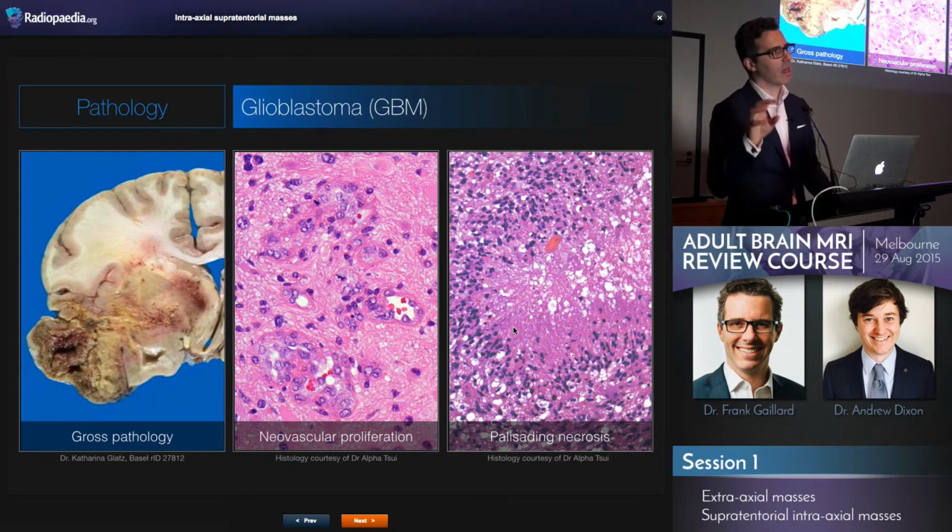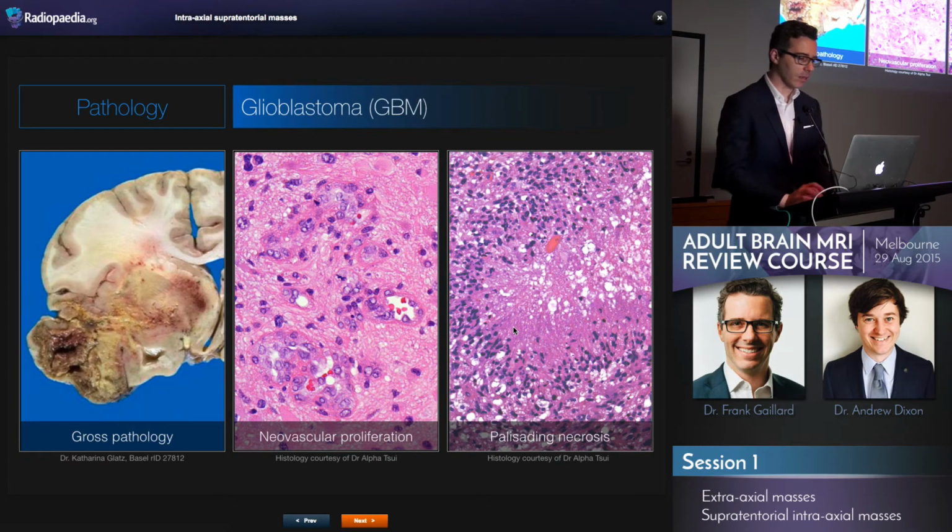And remember that enhancement in MRI is due to accumulation of gadolinium in the extravascular space largely, whereas in CT you're looking much more at intravascular as well as leakiness. So you can't confuse capillary density or vascular density on MR with enhancement. They're separate things, and for that we need perfusion, which we'll get to in a second.